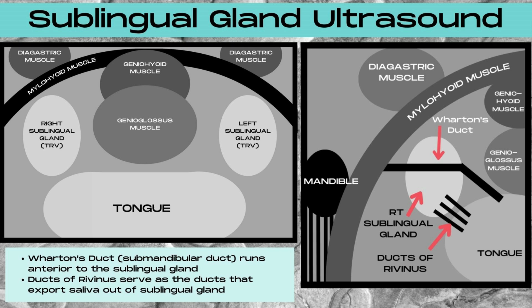Anterior to the mylohyoid muscles are going to be the anterior body of the digastric muscles. On the image to the right, you'll note that Wharton's duct travels anteriorly over the top of the right sublingual glands in the transverse plane, and this is why stones within Wharton's duct — which is actually the submandibular duct — can commonly be mistaken for stones within the right sublingual gland. Note the placement of the ducts of Rivinus: these are the ducts connecting the right sublingual gland to the tongue that export the saliva from the right sublingual gland. This would be the true location of a sublingual stone, which are rare. More commonly, you'll see a stone within Wharton's duct — a submandibular stone mimicking the appearance of a sublingual stone.